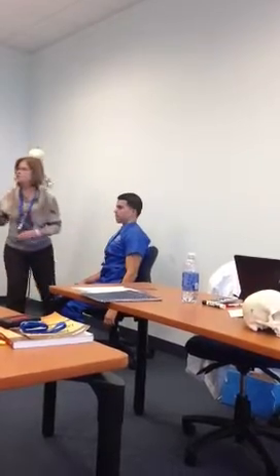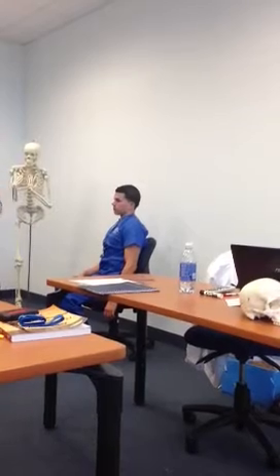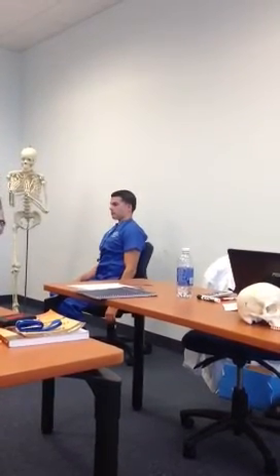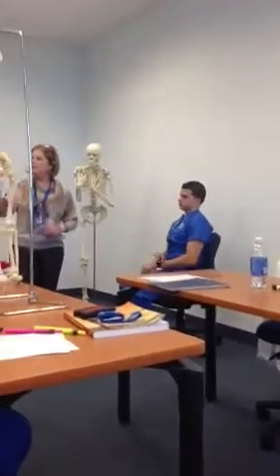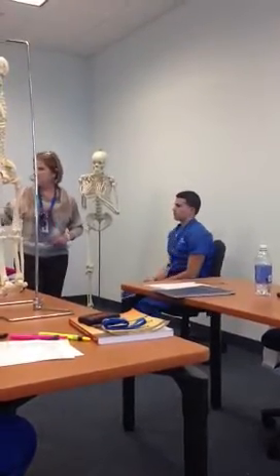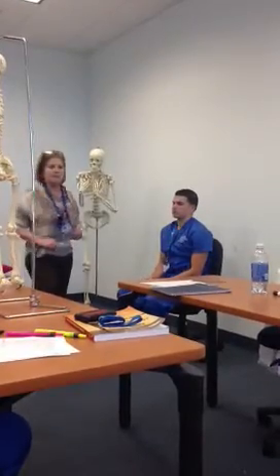Okay, so this is a tool to record how much range of motion that person has. And you do periodic range of motion assessment. It's usually the OT who does it. But to see from 1 week to the next, you go and remeasure and see if the patient improved or not, or worse.